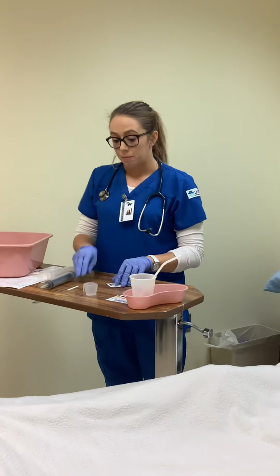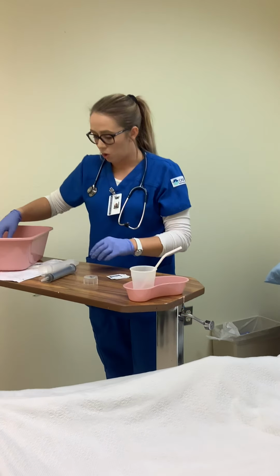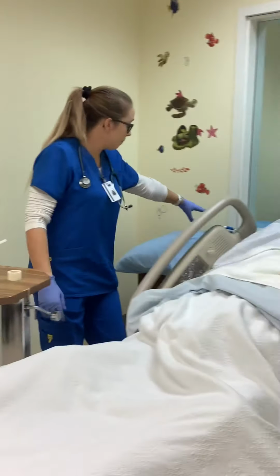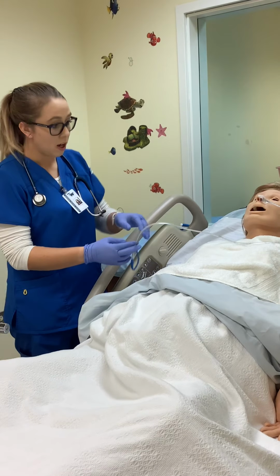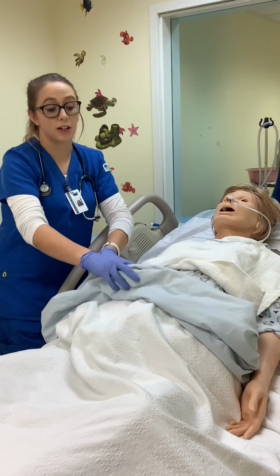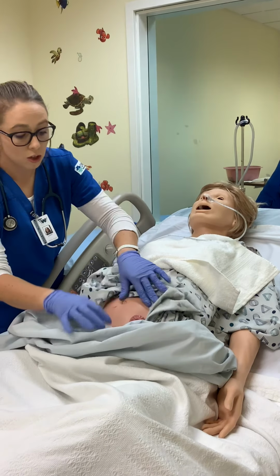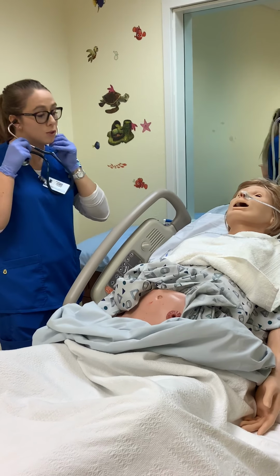Now I'm going to demonstrate how to remove the NG tube. So the first thing I want to do is turn off the suction, making sure that it is unhooked from here. And before I do that, I will lay this towel back down for purposes of the video. I just left it. I would then let Shirley know. Shirley, how are you feeling? Good, okay. So I'm just going to listen to your bowel sounds real quick before we move this, making sure everything sounds okay.